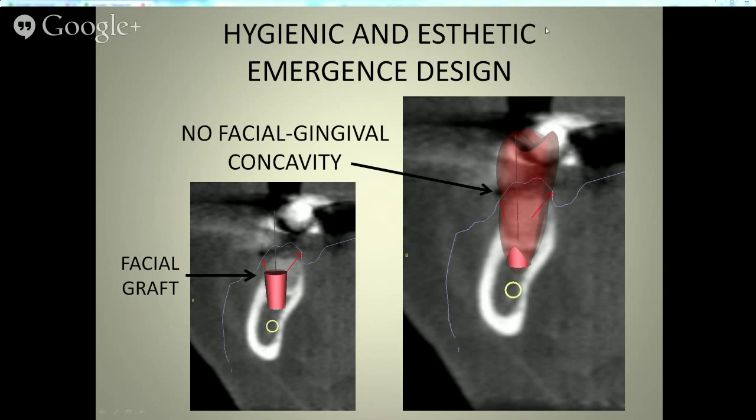If you're going to remove bone, if you do it beforehand, you can plan how much bone to remove in the software and go in and take that out and come back and put the implant in. Sure, I mean, I have some doctors that actually put the implant in and remove the bone around it. So there's techniques to do it either way.